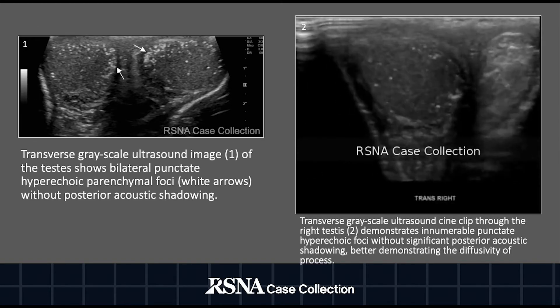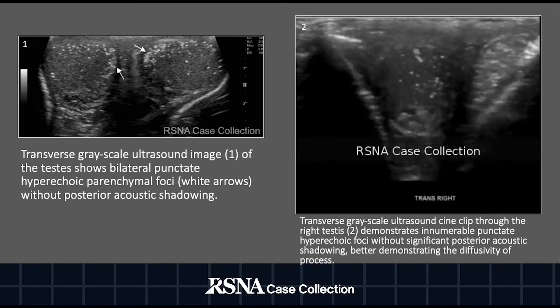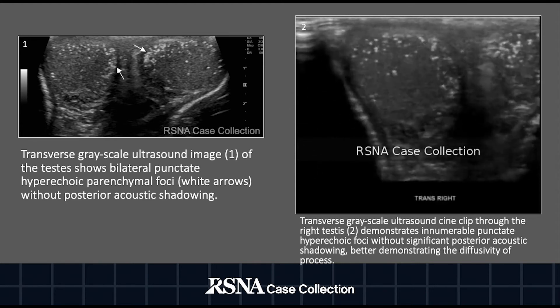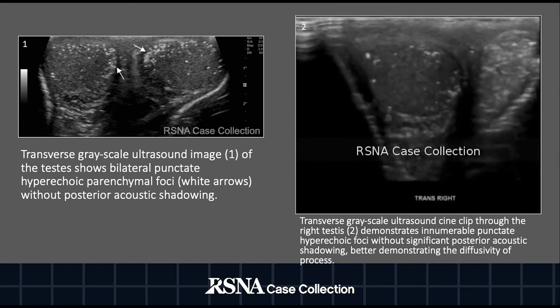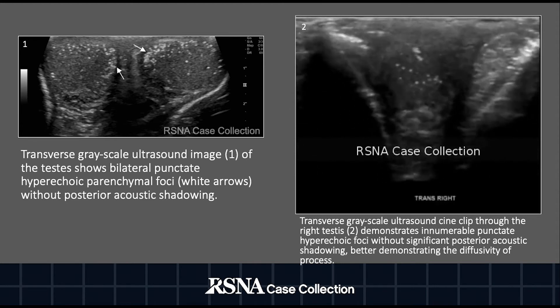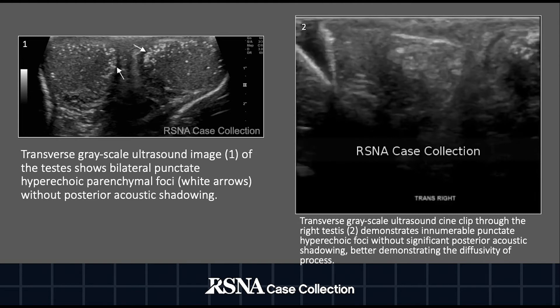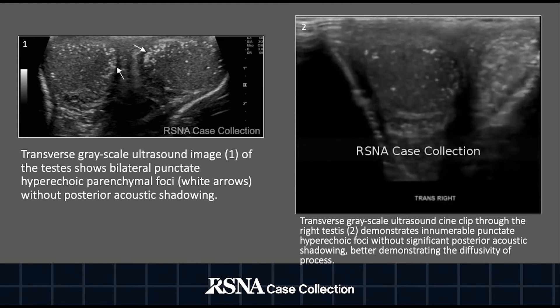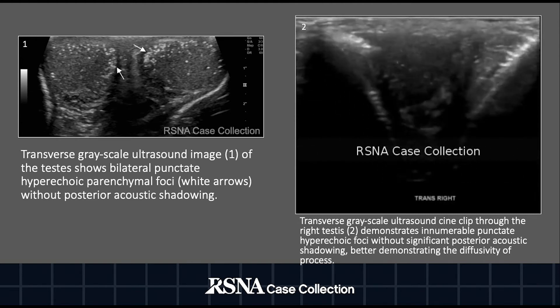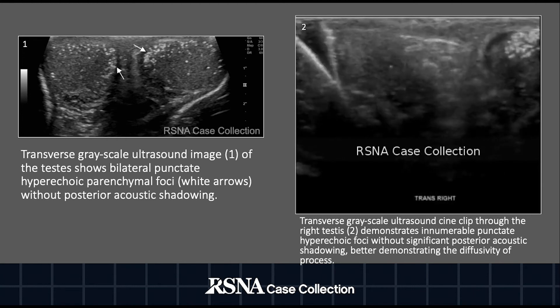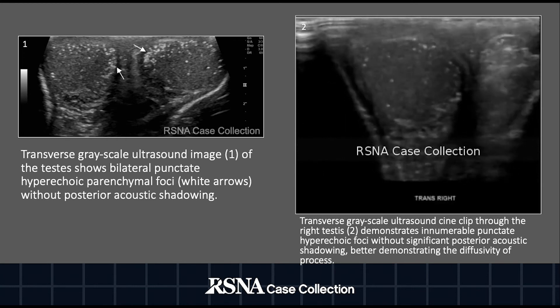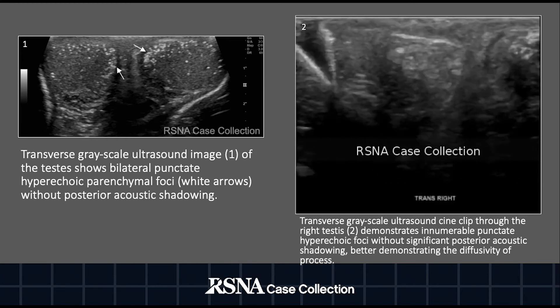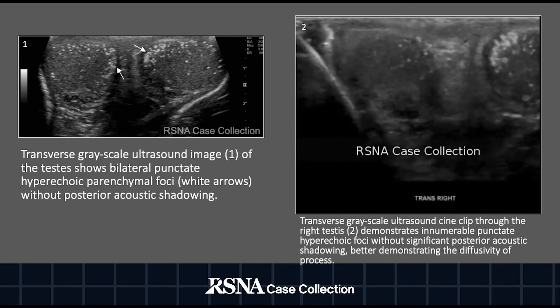Transverse ultrasound examination through the testes demonstrated bilateral punctate hyperechoic foci scattered diffusely throughout the testicular parenchyma, as denoted by the white arrows in figure 1. No posterior acoustic shadowing was identified. The diffuse distribution of the hyperechoic foci is better demonstrated on the transverse cine clip in figure 2.